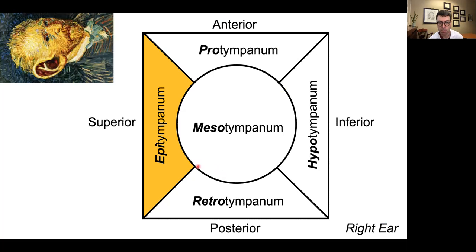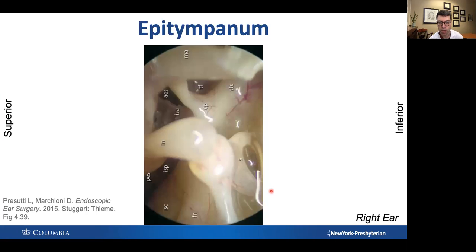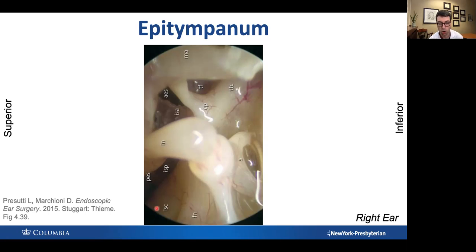Now let's go on to the epitympanum, the superior compartment. We're now looking with an angled endoscope superiorly. To review, we see the stapes again more clearly — you can see clearly the anterior crus, posterior crus, footplate, the stapes head or capitulum, and then the stapedius which connects to it. Here's the malleus again, and the tensor tympani which connects to the malleus neck. Now if you look superior, you're peering into the epitympanum — you see the anterior epitympanic space and the posterior epitympanic space. This is cool: you can see the lateral canal with endoscopes. I've never seen a lateral canal with a microscope unless we were to do a canal wall down.